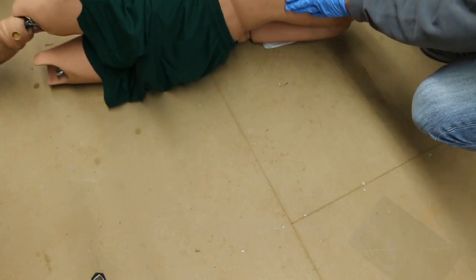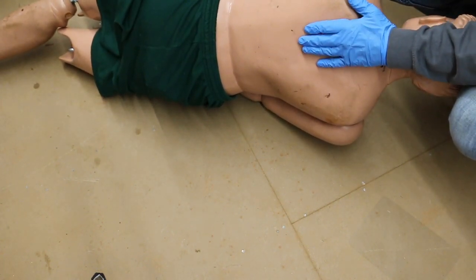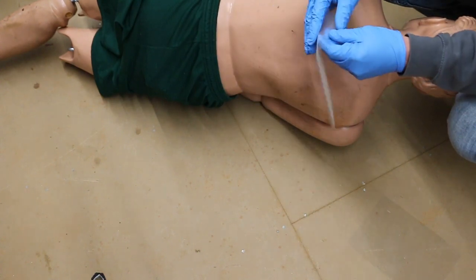And we have another hole here. Whether that be an entry or an exit wound, have another hole back here. So then, pull out your non-vented chest seal.